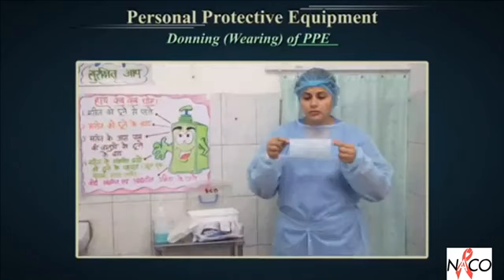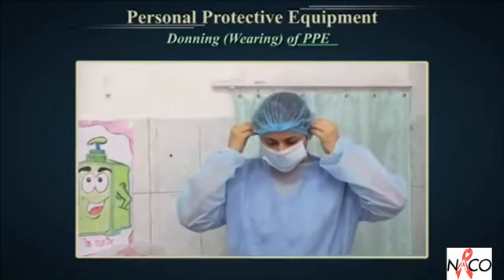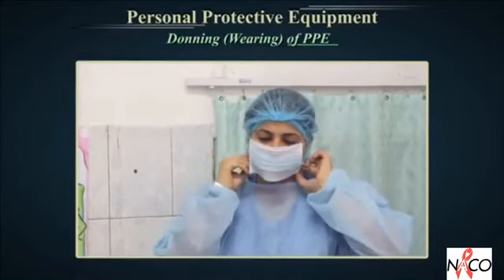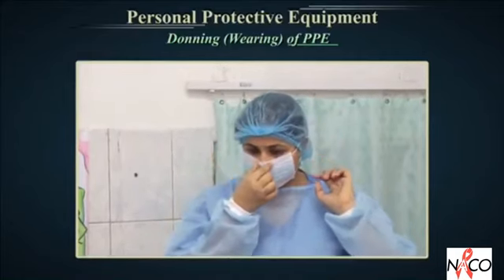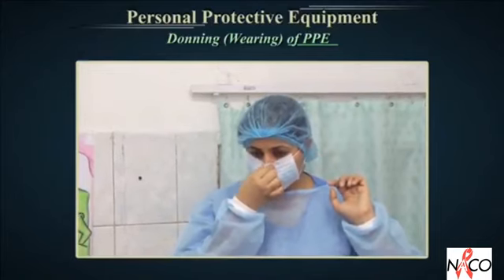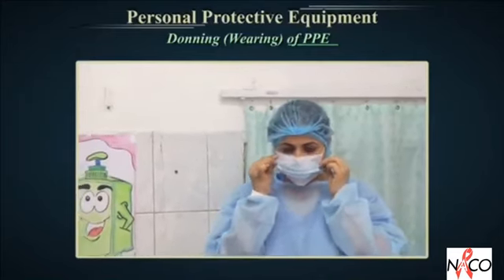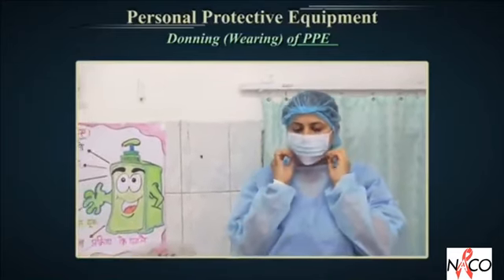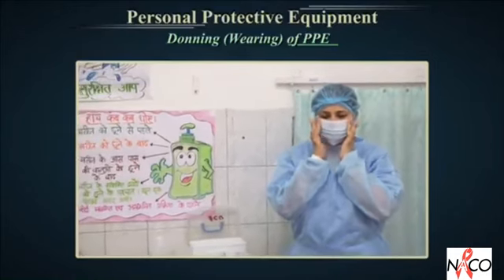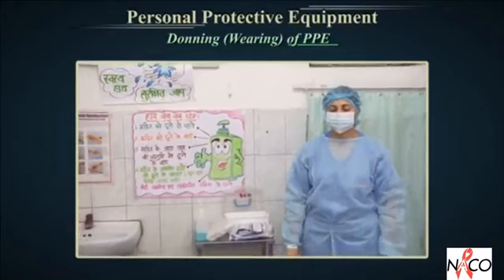The third step is providing respiratory protection. A simple way is to use a procedure mask. They are used for droplet precautions. Droplet precautions are used in the care of influenza patients. To apply this mask, gently crease the metal insert to create an indentation for your nose. Then cuff the elastic bands or tying ends around your ears and spread out the mask across your face from the bridge of the nose to below your chin. Finally, ensure your mask is snug and comfortable over your face.